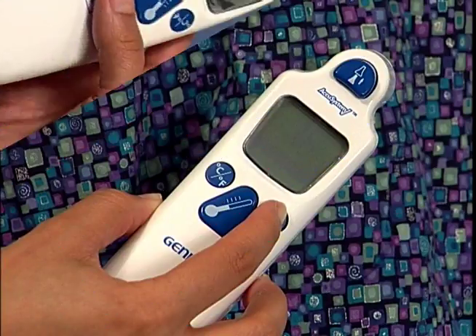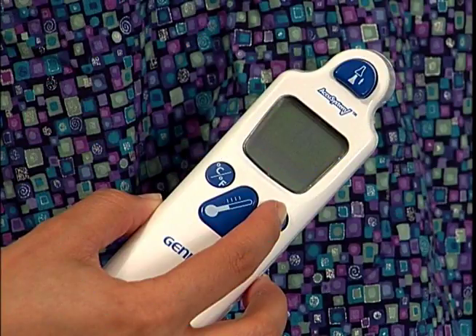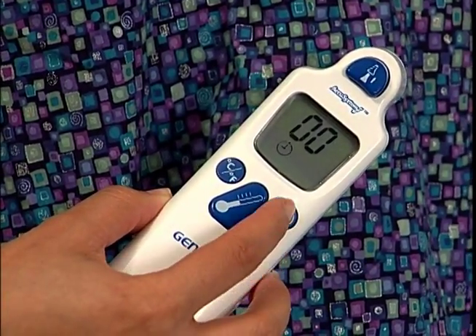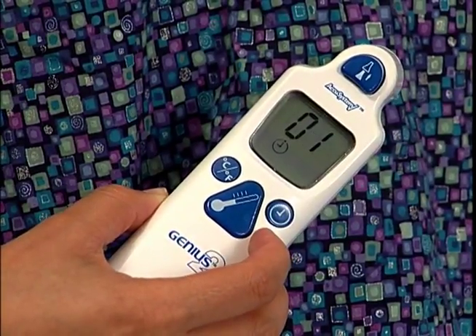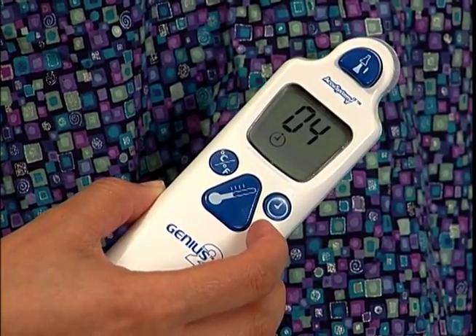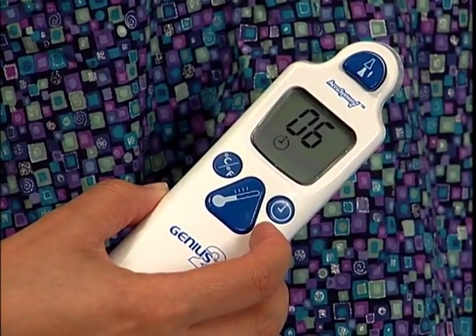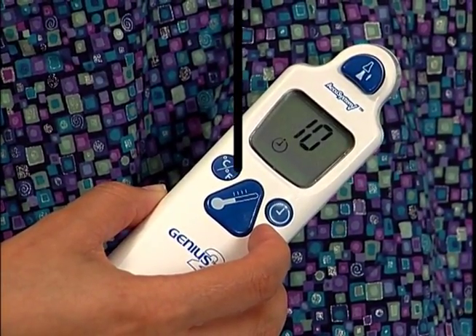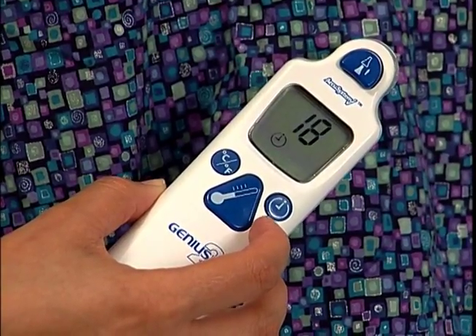To activate the pulse timer, ensure a probe cover is not loaded. Then press and hold the clock icon button. Press and release the pulse timer once to start the countdown. Beeps will sound in 15-second intervals. If finished with the timer prior to a full 60-second countdown, press and release the timer button once more to deactivate.